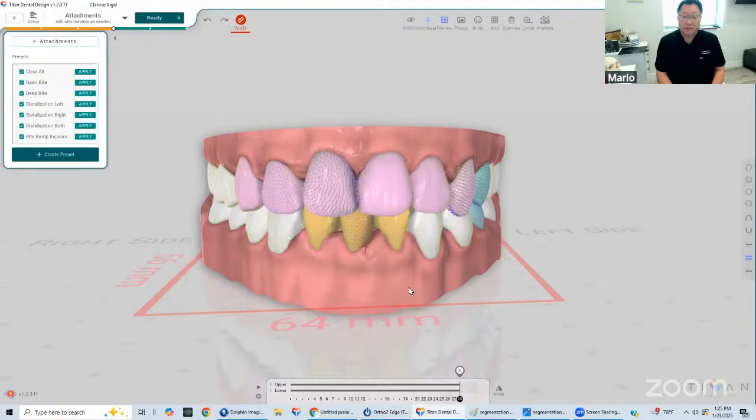Yeah, my comment about the cone-beam CT is that I absolutely do agree with you. I think radiation is really not a big factor. The one item I do believe is still going to be a factor is the availability, cost, and access of radiation, affordability and access globally.